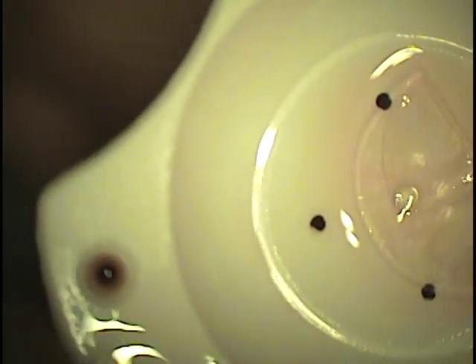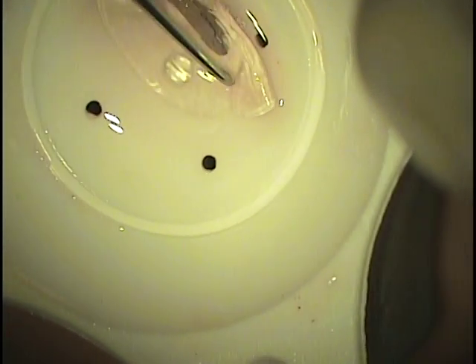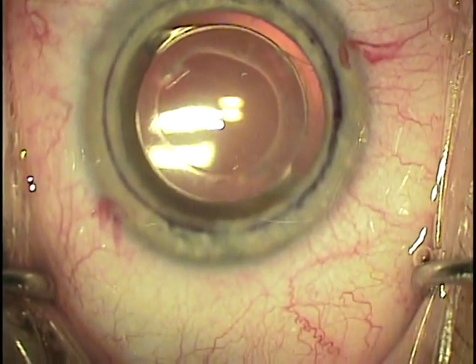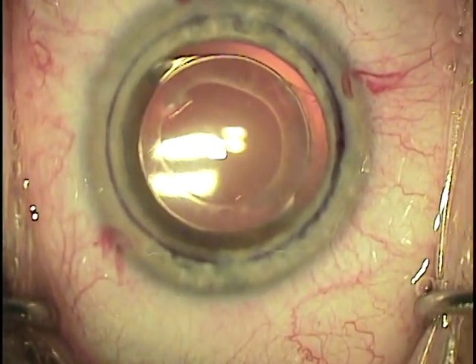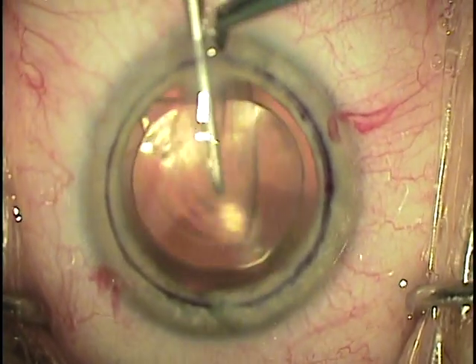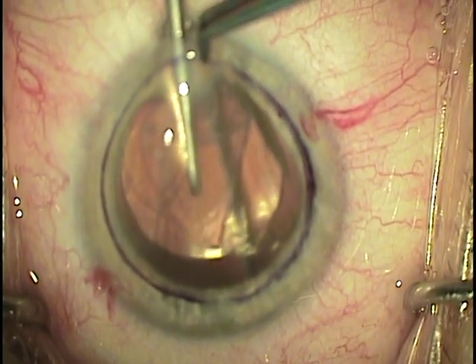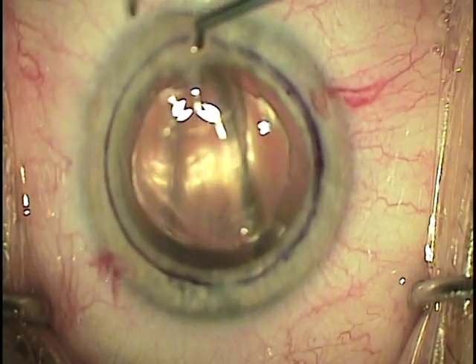Point fixation forceps are then used to grab the folded donor tissue which is then inserted through the clear corneal incision. Point fixation forceps are sometimes a little slow to let go of the tissue and it is important not to extract the tissue when removing the forceps.